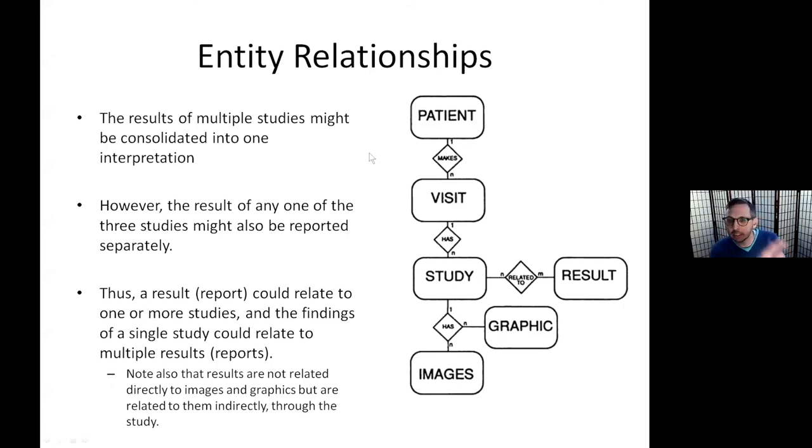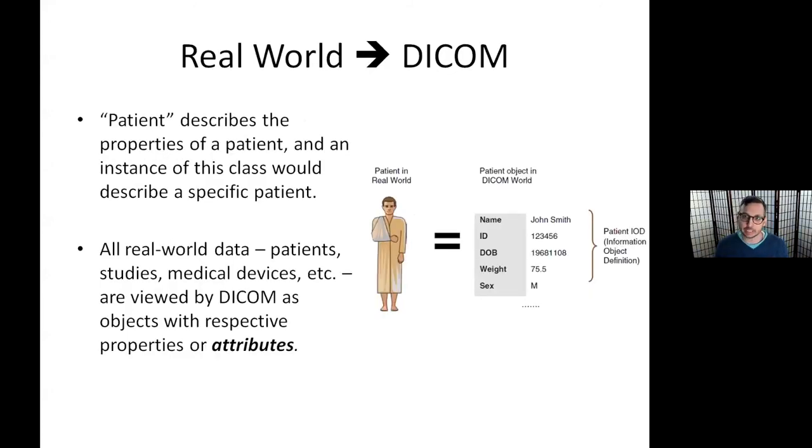And like I said, there's a lot of words here. You can come back and read these later. And I'm going to send this out to you. You don't have to catch everything the first time. Hopefully you're interested and you want to learn more. That's really my hope, that you realize that DICOM is really powerful. And if I know this language, just like if I know English, I'm going to be able to communicate with a lot more people than I can currently.